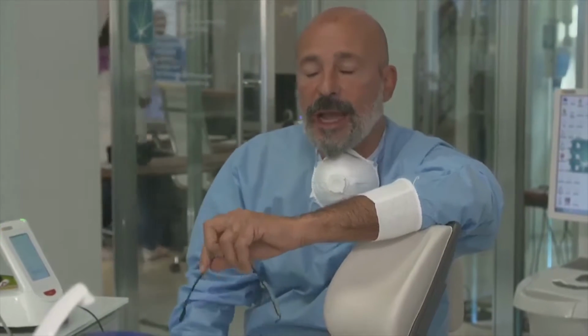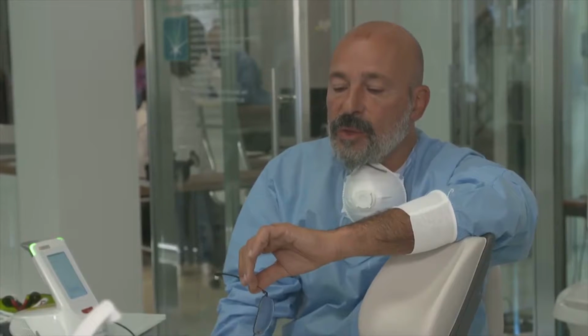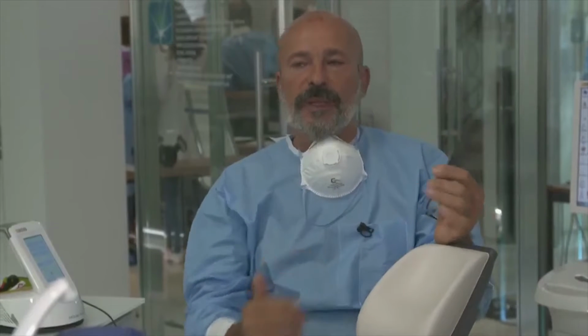Because, as Professor Brown also showed yesterday, and we know very well, using the 970 we have a little bit of absorption also in water. So the transmission of energy to the tissue is more gentle, but only on the fibrotic tissue. You always have to look at the color of the lesion. If the color is red or red-blue, the best solution is 445 because there are vessels, there is blood. So we will use the 445 as the first choice.